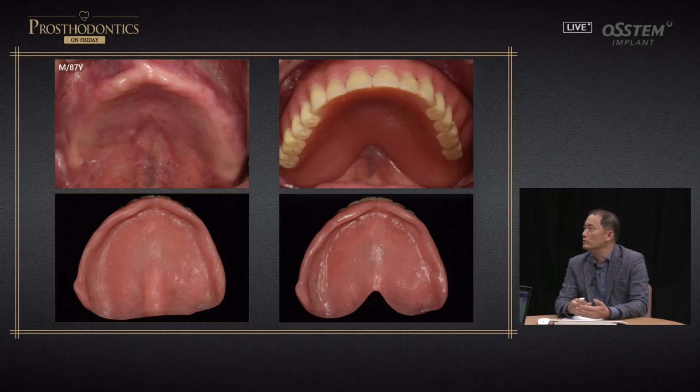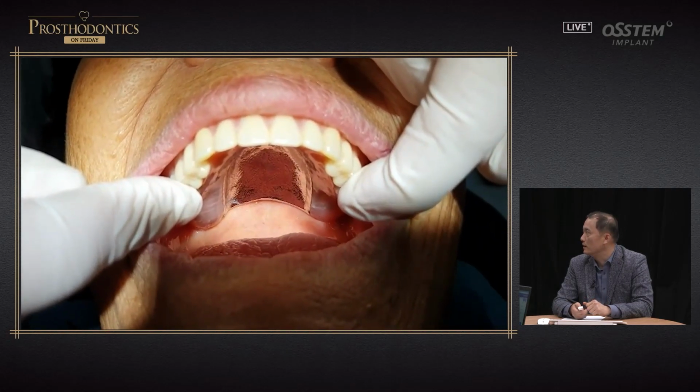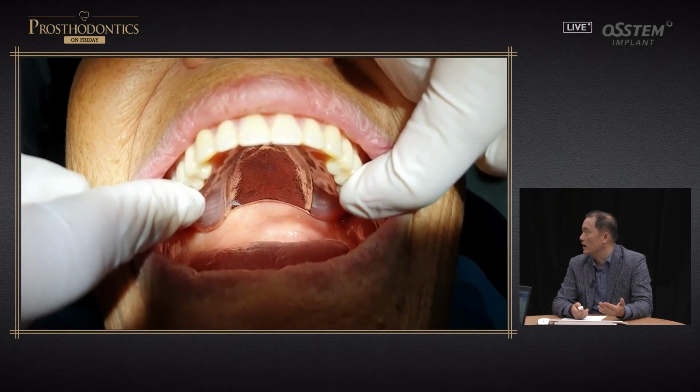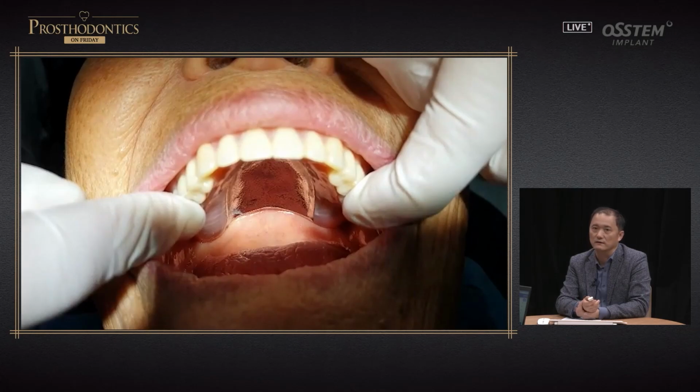So the AH line, especially when it comes to maxillary alveolar ridge resorption, even with a small extension or small stimuli, the denture can be detached. So in such cases, you have to make the right AH line and use that for retention. So again, as you can see here, for the distal extension, you stop it where the AH line is, and that seems to be the ideal approach.